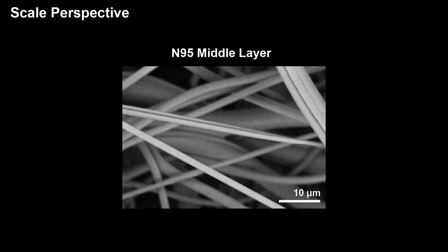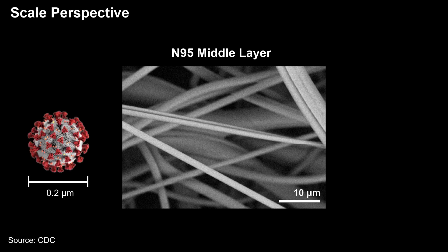You may be wondering how the feature size on the mask compares to the coronavirus. We know that the coronavirus is about 0.2 microns in size, and this is how it compares to a fiber on the N95 respirator. As you can see, the size of the coronavirus is about the size of the red dot — that is only one sixth of the fiber on the N95.